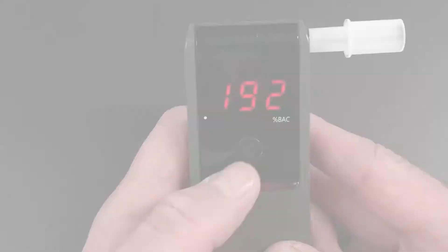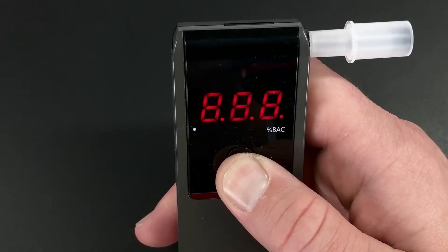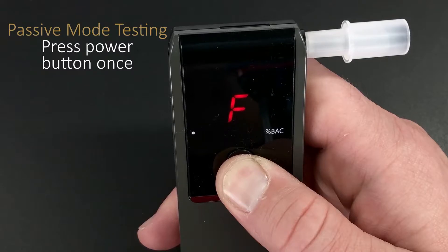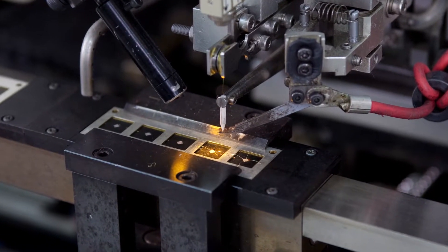If you want to test continuously, just press the button once after the result is showing. And if you want passive mode testing, just press the button once when zero appears, then you can see a pass or fail reading.